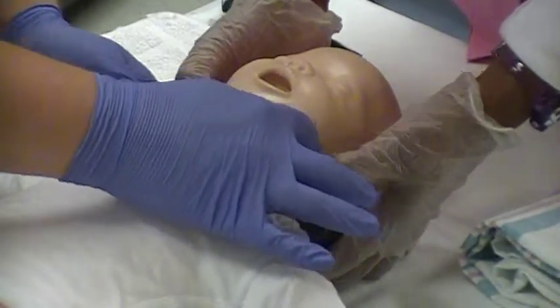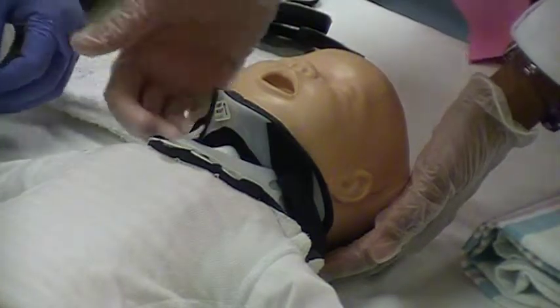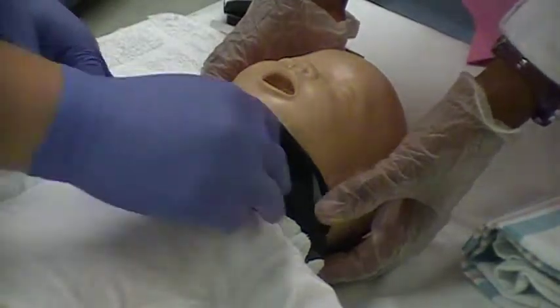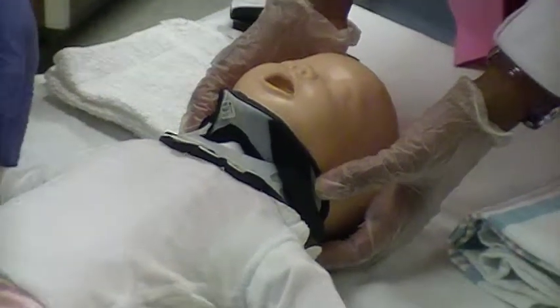Collars should not touch the tracheal area in the front. Adjust front and back flex tabs to improve fit and comfort. Perform a neurological exam and obtain x-ray imaging per the physician's order.